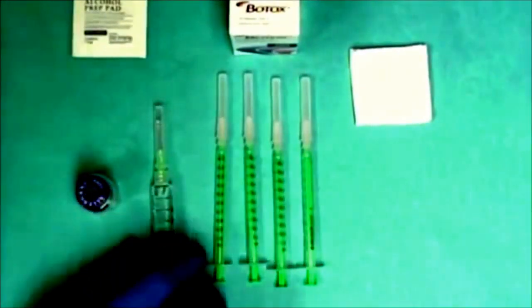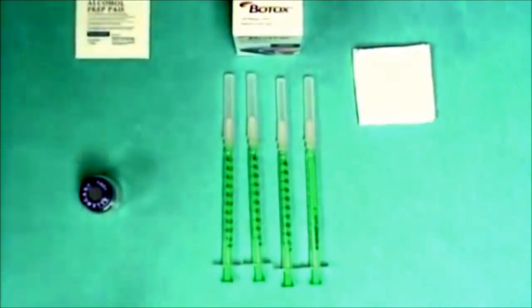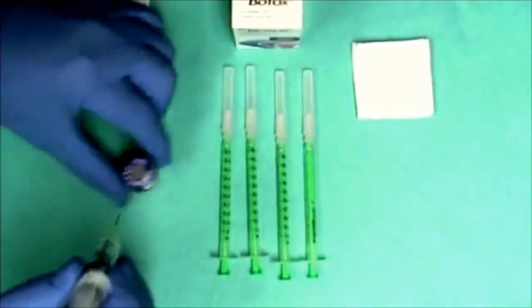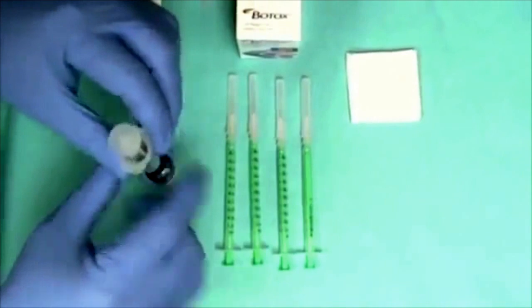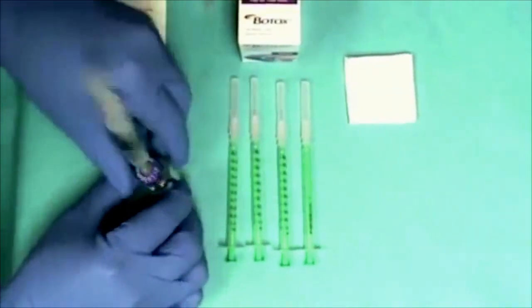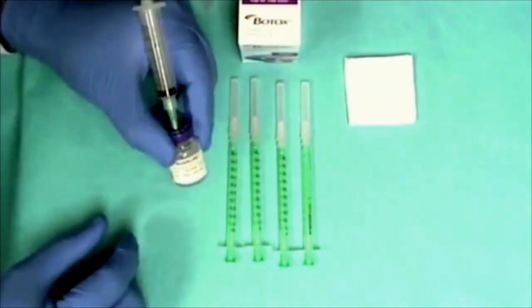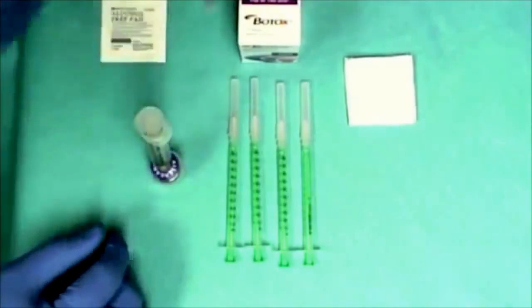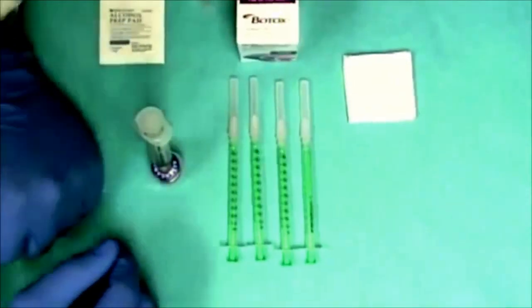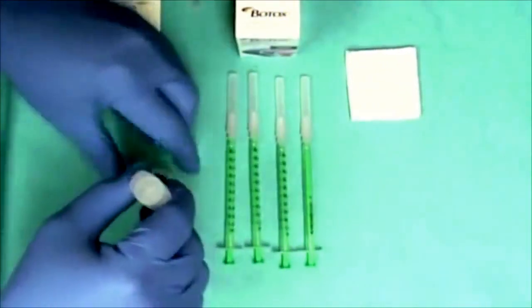Use the same needle to stick into the Botox vial and let the vacuum aspirate the saline to the inside of the vial. If no vacuum occurs, do not use this material and contact your supplier to inform its lot and number, as it is not safe.